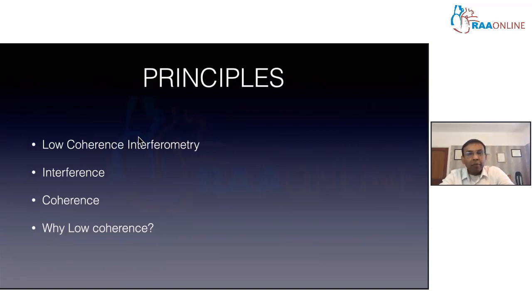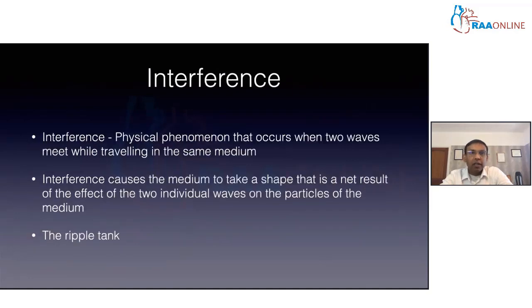Throughout this talk, in the first half, I will try to stress getting the listener to understand the principles of the OCT scan, because once you understand the principles, the interpretation of the image becomes very straightforward. I hope you're with me so far. We've talked about low coherence interferometry and what OCT stands for. Now let's look at what interference is and why it is important.